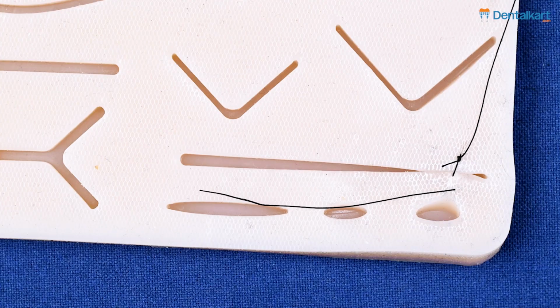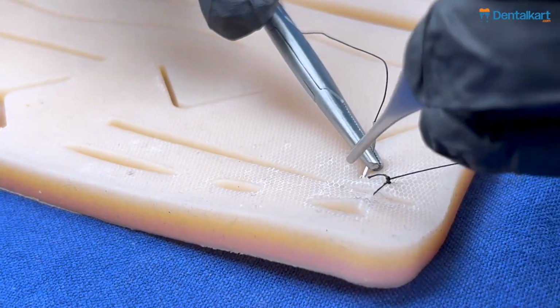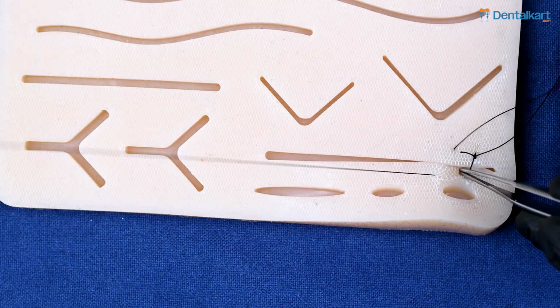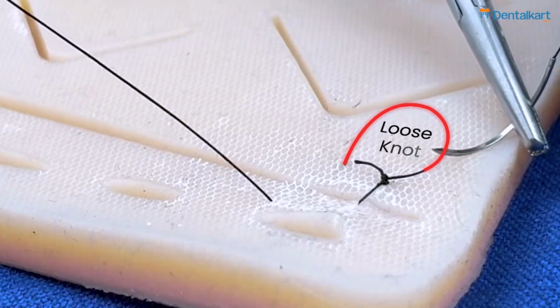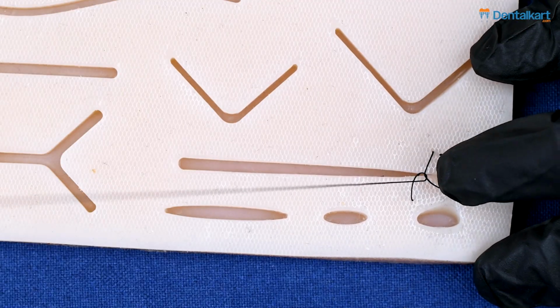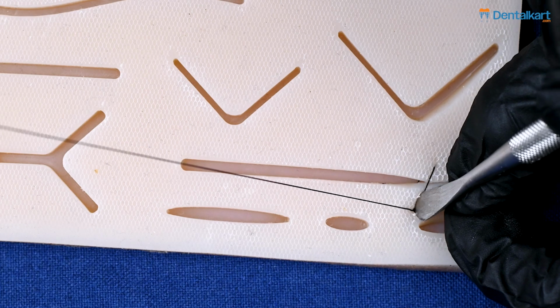The long end of the thread is used to pass the bites for the subsequent suture, and just before tightening this, we keep a little bit of knot and we pass the needle through the knot to create the lock. So this is the key part while doing a continuous locked suturing. And as you can see here, we are going to adapt this knot closely as much as possible.